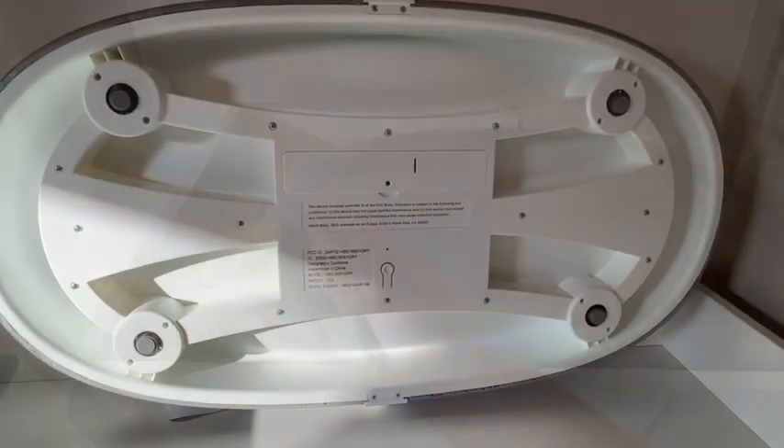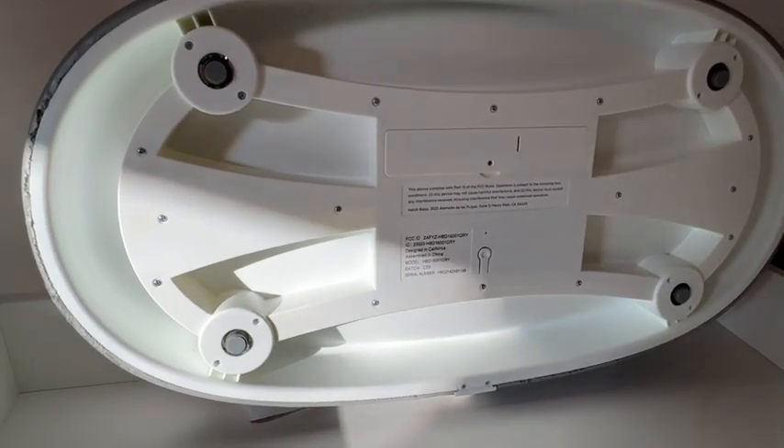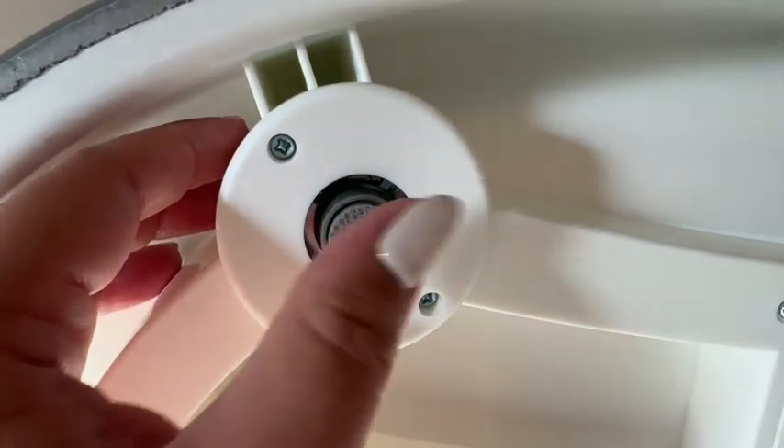Or just to keep up with the weight in between doctor's visits. The material it's made with is really easy to clean as well and nice and comfy. And here's a look at the bottom — I love that it has these little legs so that it can be nice and balanced on a hard surface.